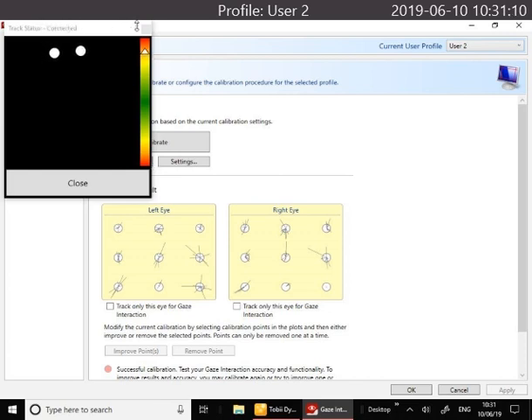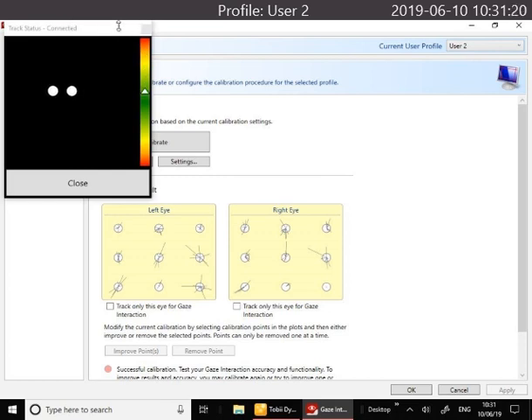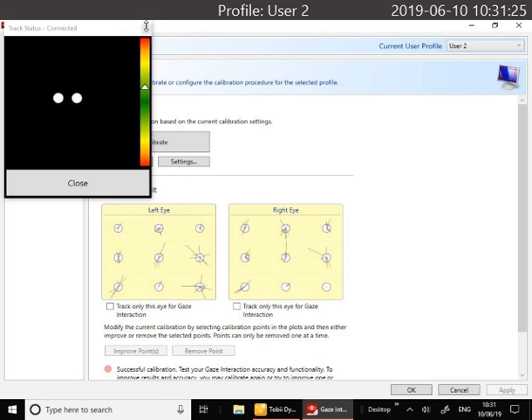You can see at the moment my eyes are quite high in the box and I'm too close to the screen, and I know that by the arrow being in the red section at the top bar there. What I need to do is reposition either the device or myself so that the eyes are in the middle of the box and the arrow is in the green section of the colored bar.